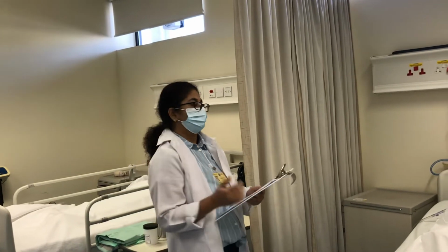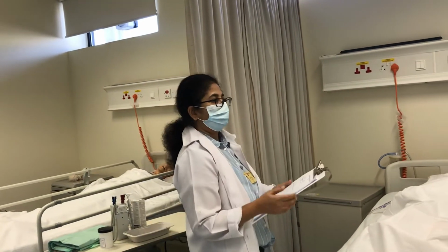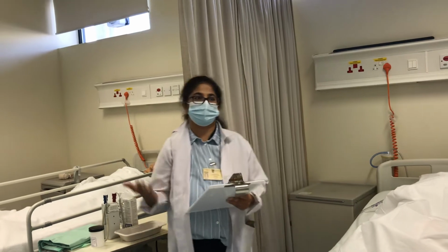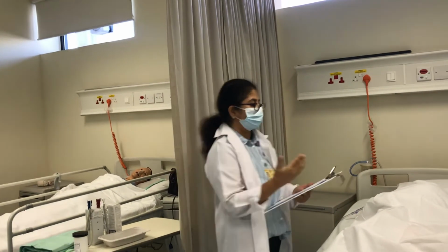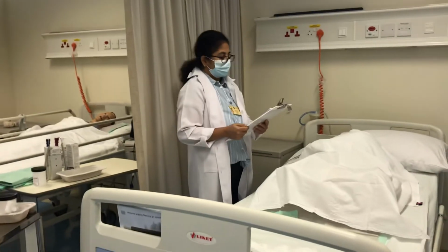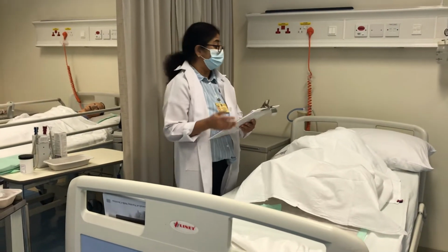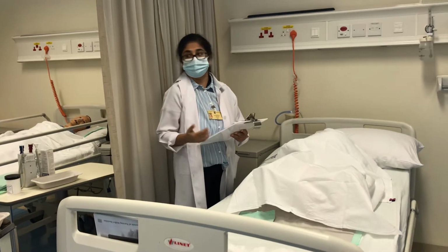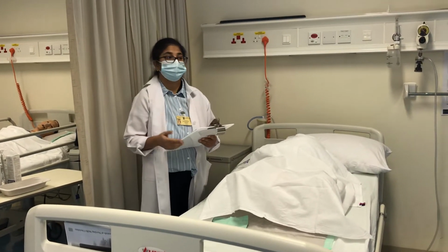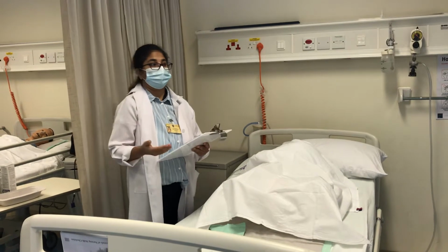So what all things will we assess in the patient? That is just like any other procedure. We will go to the patient, introduce myself, and all those initial steps we follow. Then I will see that the patient is cooperating with you. That is one of the important things, because otherwise it's going to be a little difficult.